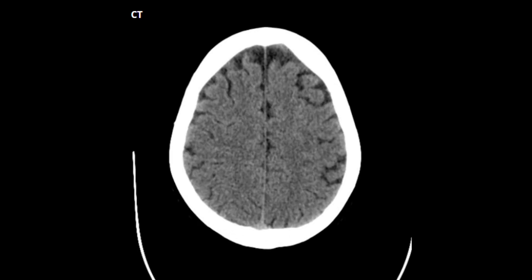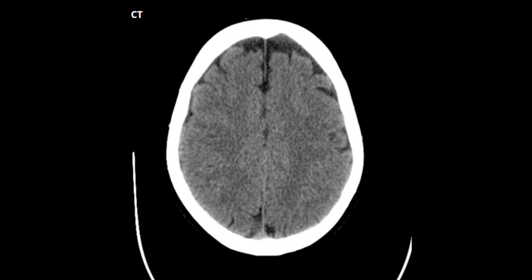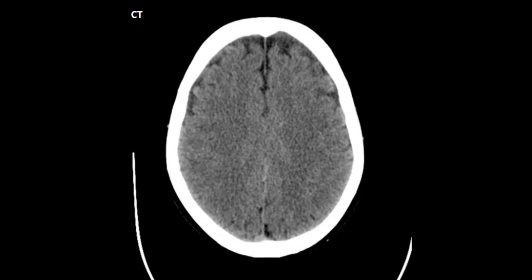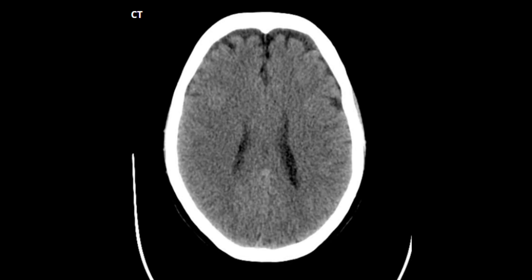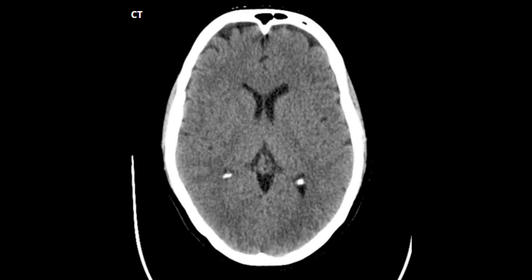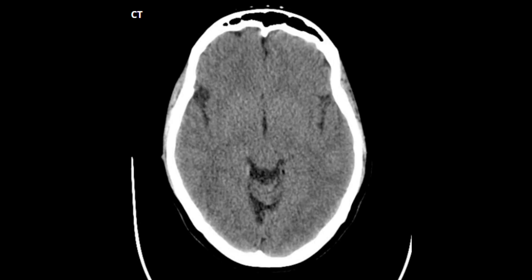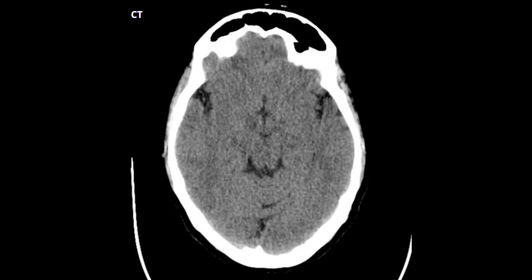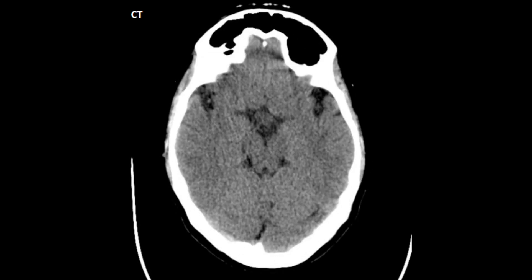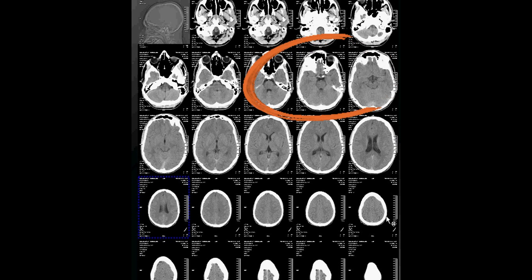As I told you in the previous video, when we scroll down towards the base of the brain, we see multiple deep CSF-filled spaces which are known as cisterns. Some of them were discussed in the previous video. On a CT film, these slices are usually used to visualize the cisterns.